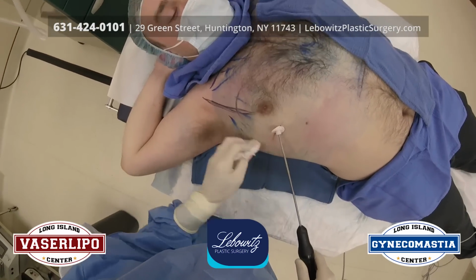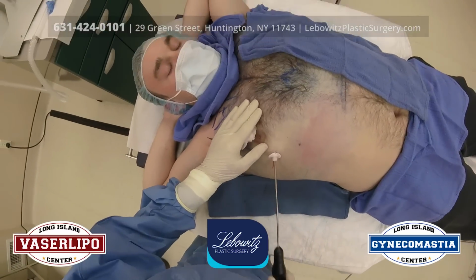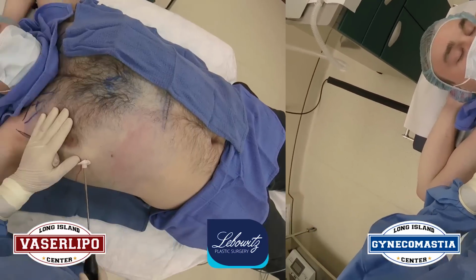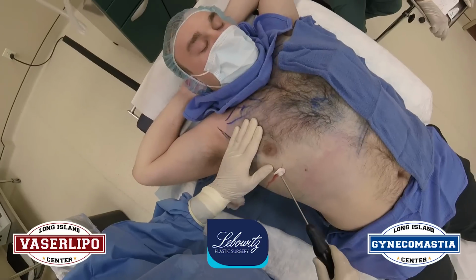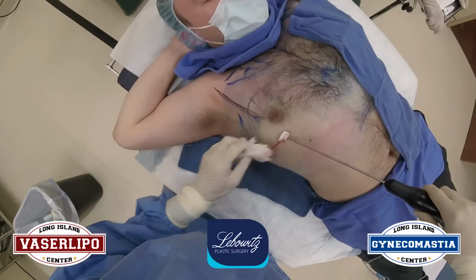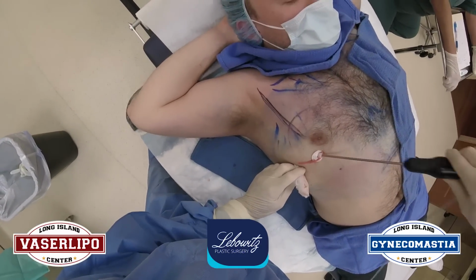And you're going to see some fluid coming out. That's the fat that we just can't contain. You all right? And it's under local. Feel anything? Pain from 1 to 10? What is it? A 0? A nothing. Now we're going to go to this negative space right here.